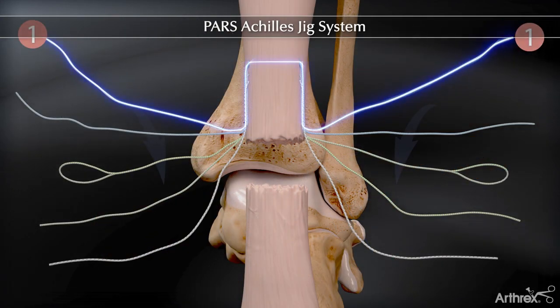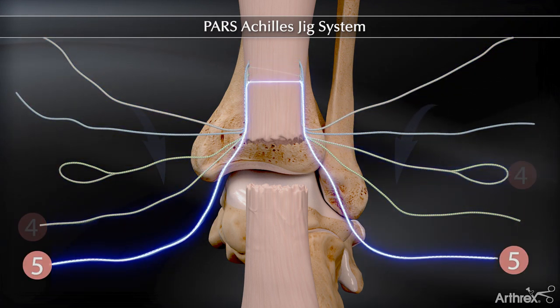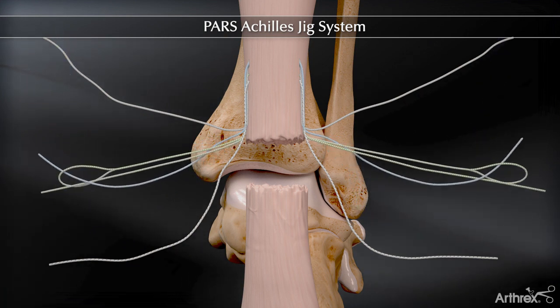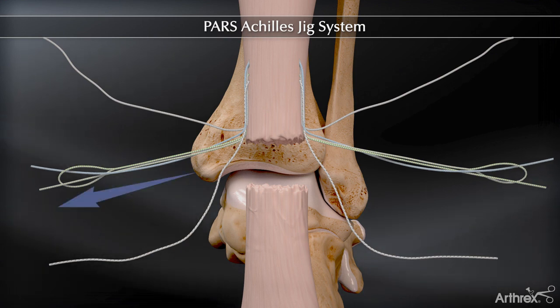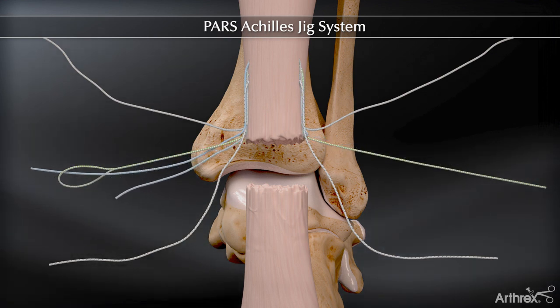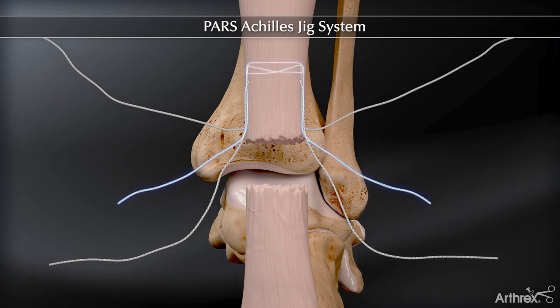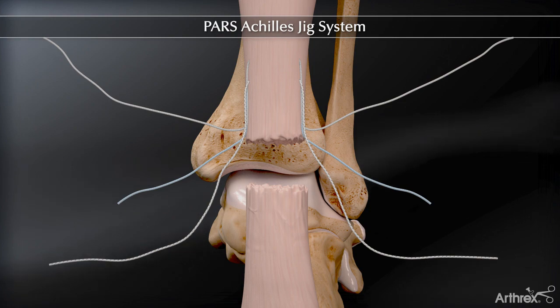Organize the sutures as they were originally placed in the jig. Pass the number two blue suture under the number three and number four looped sutures and back through the loop of the white-green looped suture. Pull the number two suture through the Achilles tendon to the other side by pulling on the non-looped side of the white-green looped sutures, creating a percutaneous locking stitch.